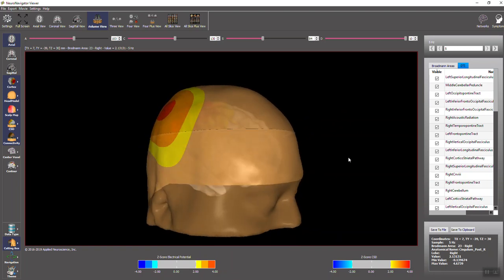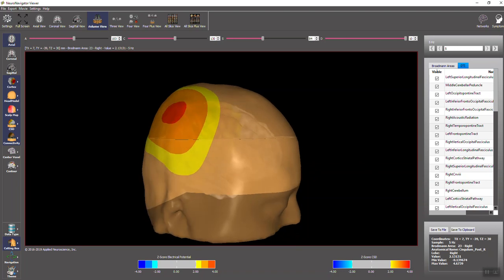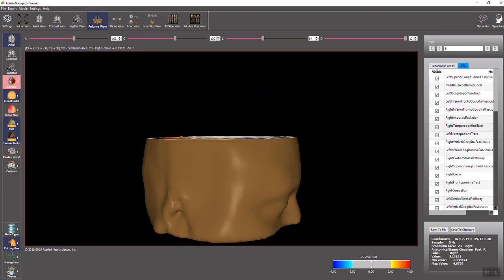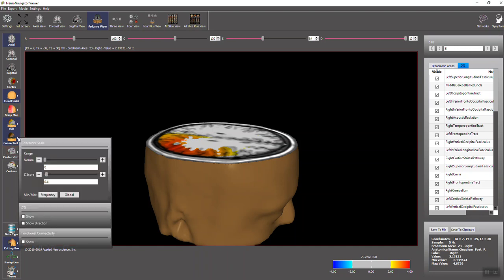I can remove the scalp, and you can see the cortex is deviant from normal, but what I want to show now is, I can also remove the cortex, and we can look at the slices. In this case, it's the axial slice, but now I want to demonstrate the addition of diffusion tensor imaging.